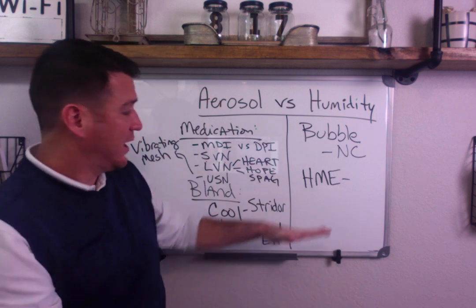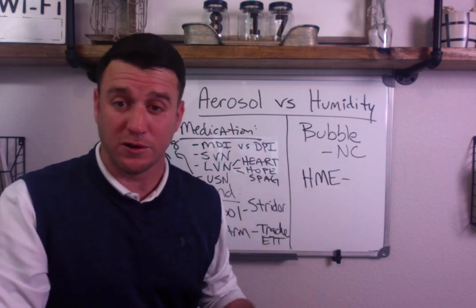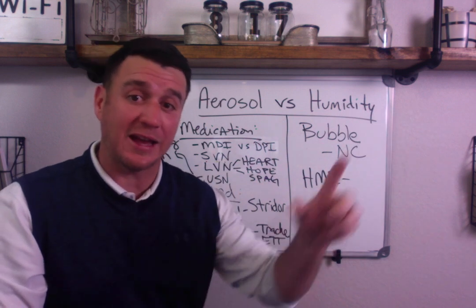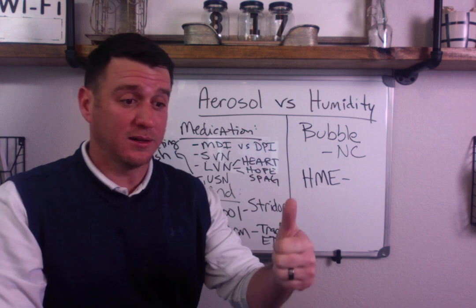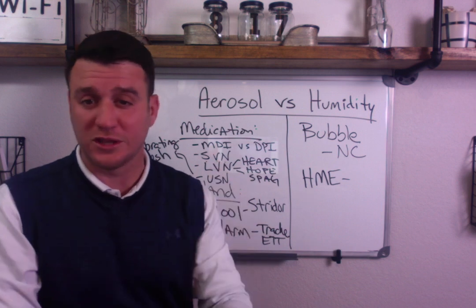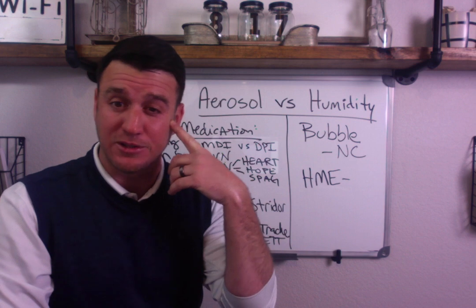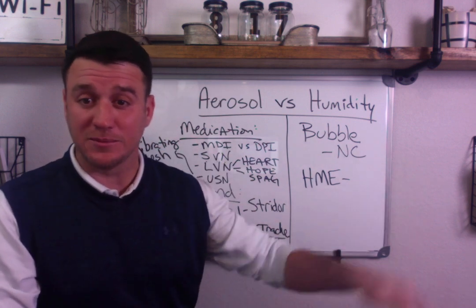Okay? So HME, think short term. So let's say you have a patient on a passover and you got to go to CAT scan. You should probably put this patient on an HME during that trip. Okay, this is a short-term option to provide heat and humidity to your patient on a mechanical ventilator. Remember, if you ever have super thick secretions, you need to ask yourself, the HME is probably not the best option. Let's get this patient on a passover, on a heated circuit, and let's maximize mucociliary clearance.